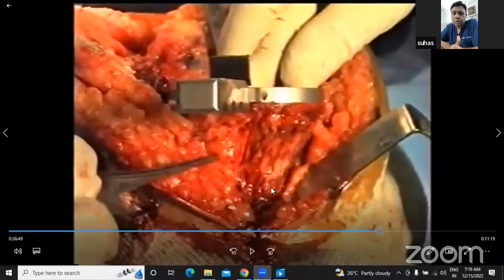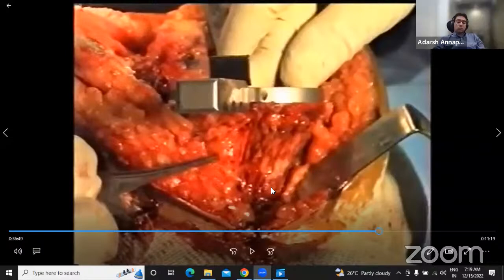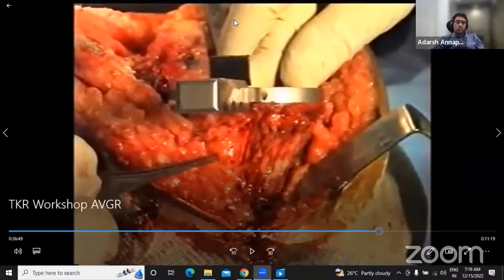So if you have any overhang, don't accept anything posterolateral or anteromedial. Anterolateral overhang is sometimes acceptable, and any overhang posteromedial is acceptable. The way to remember is what soft tissues can impinge. You should not have the MCL impinging or the popliteus. So no posterolateral or anteromedial overhang is acceptable. Okay, thank you.